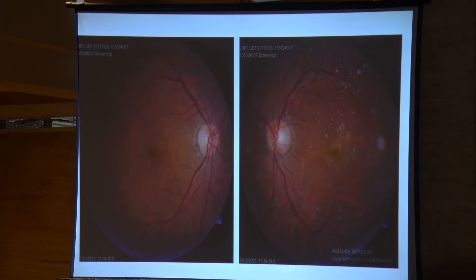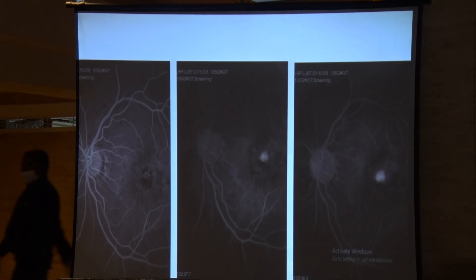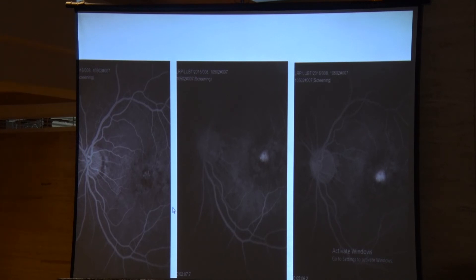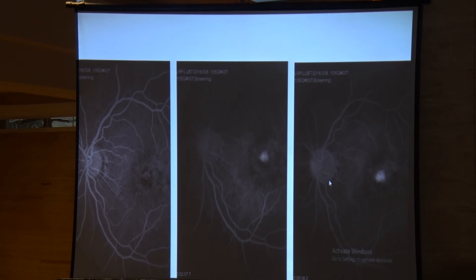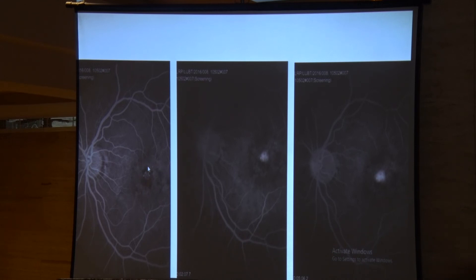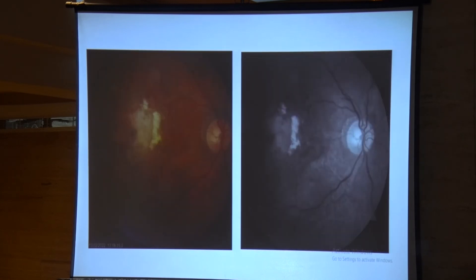These are photographs from a Zeiss machine, outlining ideal cases of CNVM. These things can also be caught by OCT or OCTA, and even better by OCTA in terms of depth. But the complex CNVM is clearly demarcated with leakage visible — showing which part of the disease is actually active. You can also see what the diseased RPE is, which will determine visual prognosis even after anti-VEGF treatment.